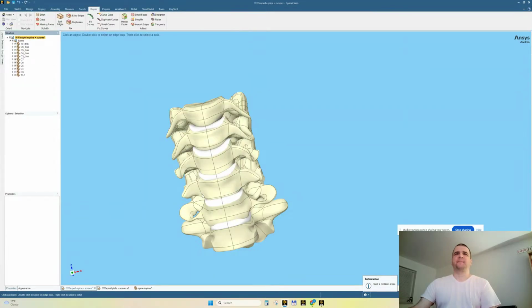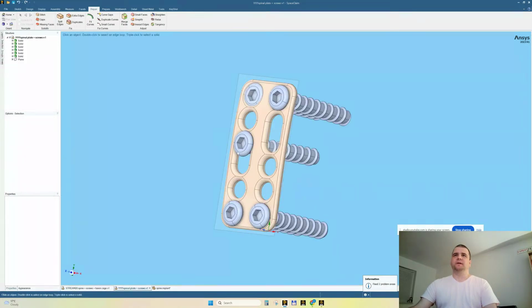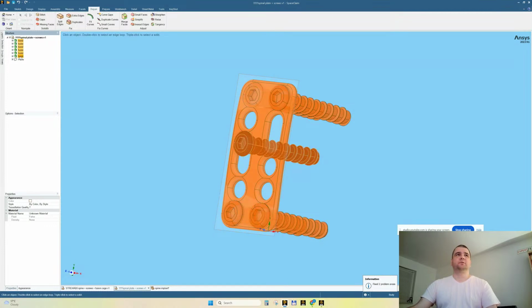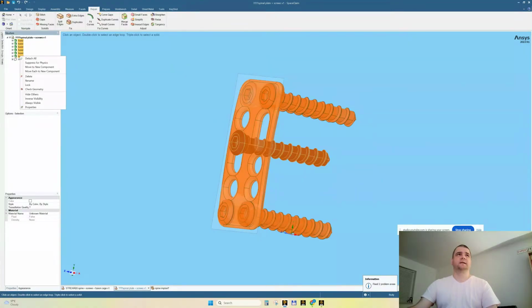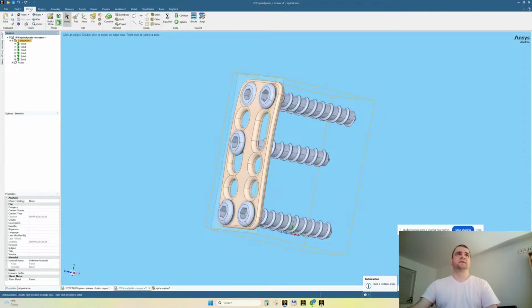So I saved this. Now let's begin bringing what we have. We have this assembly. Let's select all of them with Shift or Control pressed. Right click, move to new component. Why am I doing this? Because I'd like this top subassembly to go to the design tab, and we have a copy here. Copy.